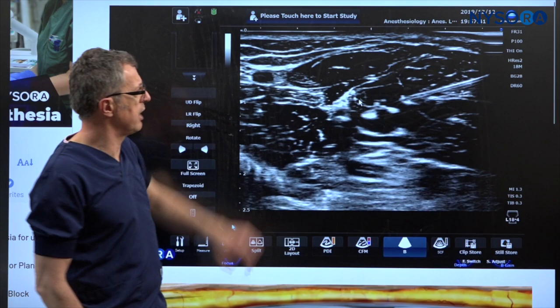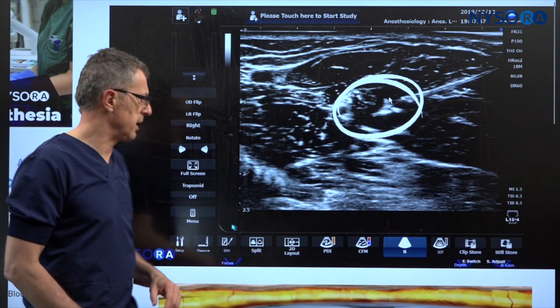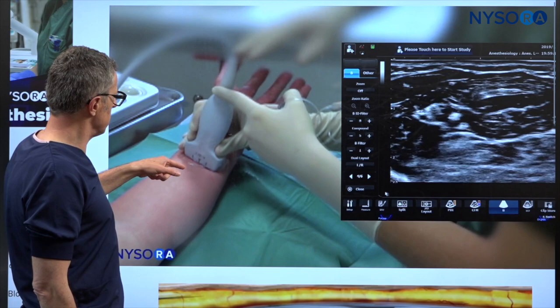The needle is placed in-plane, aiming for the fascial plane. Here we can see the needle entering the sheath, and we can see how the median nerve is being pushed back with injection of the local anesthetic. Let's move on to the ulnar nerve block.